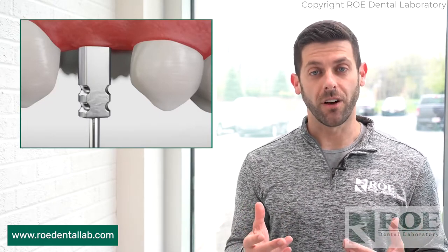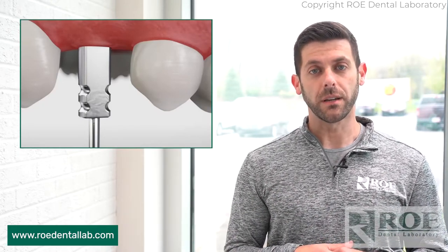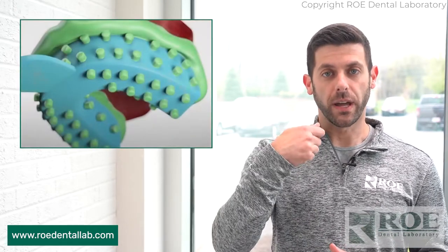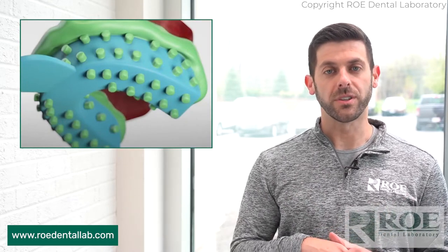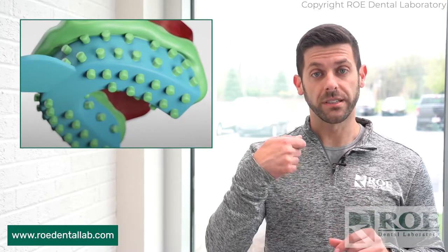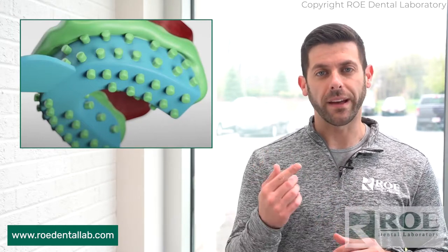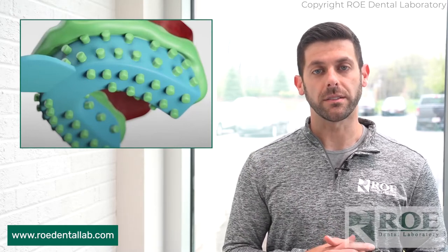If it is not seated all the way, we're going to still fabricate your crown — we can't tell — and the crown is going to be short. So please make sure it's seated all the way, then go ahead and take your impression material, heavy body or light body. There's no reason to take a wash impression with an implant. Prior to seating the material and taking the impression, you want to make sure you block out the screw access hole on the closed tray impression post.